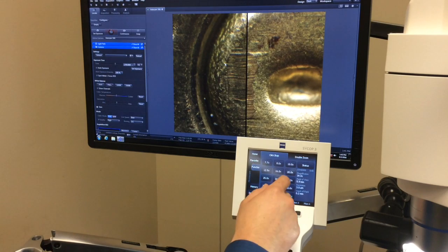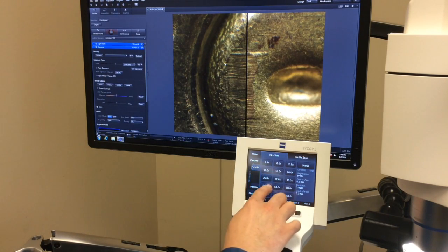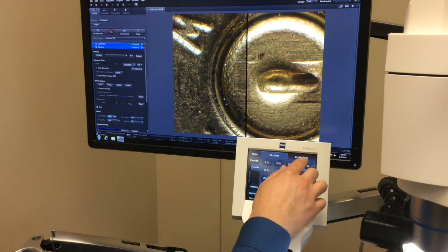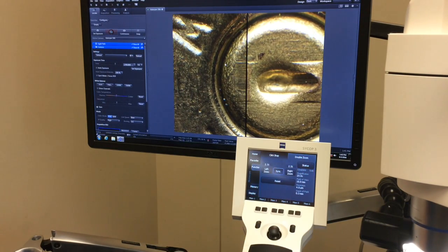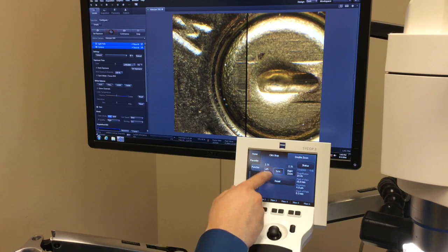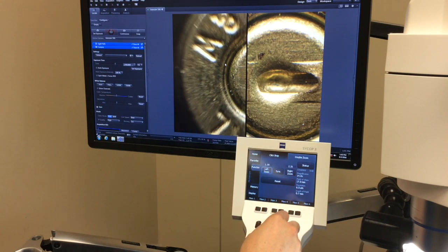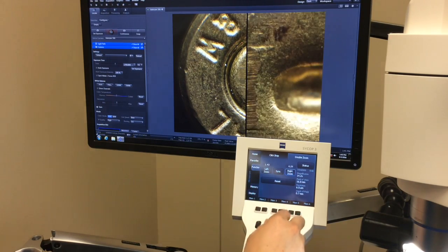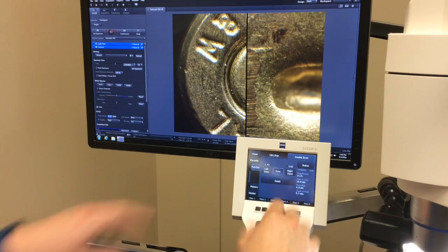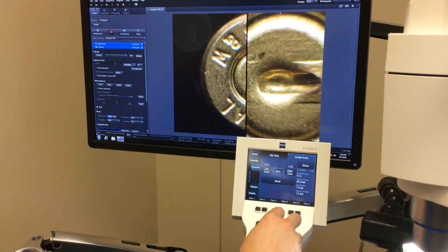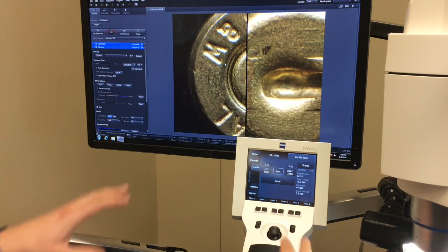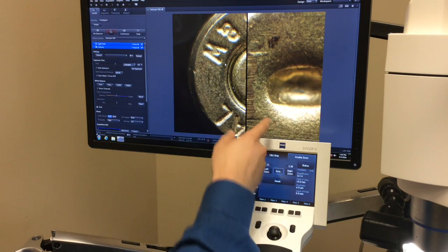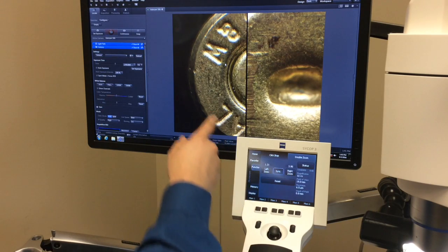The PSYCOP also has the ability, in addition to the click stops and freehand zoom, to use a double zoom feature where we can desync the two zoom bodies so one zoom body moves at a time. You can select the left zoom body or the right zoom body, and then synchronize the two as they're offset. Now when I change my magnification, they're both going to move simultaneously. At any point in time, I can hit the reset button and the right zoom body will go back to the magnification of the left zoom body.